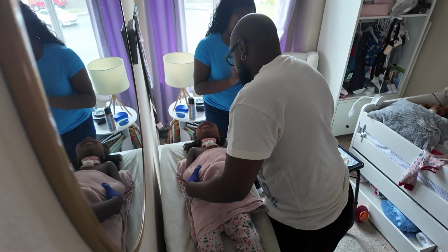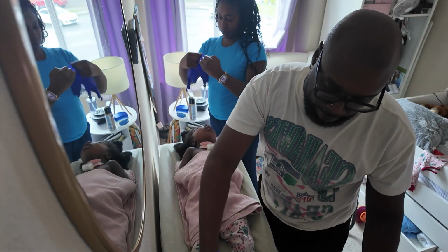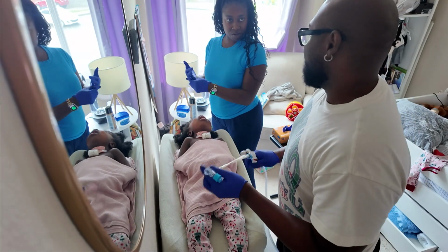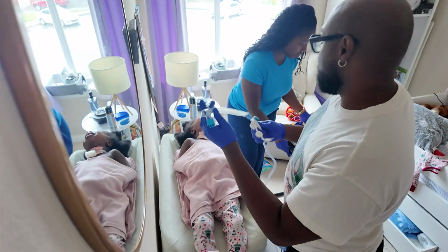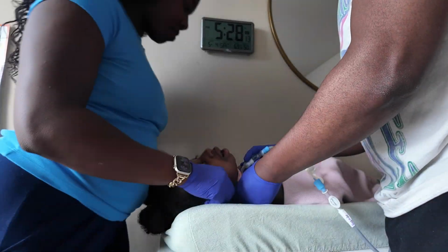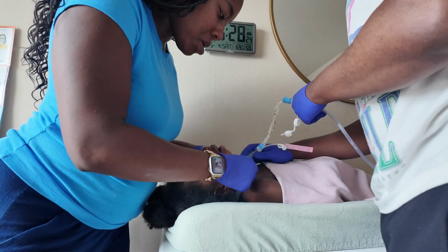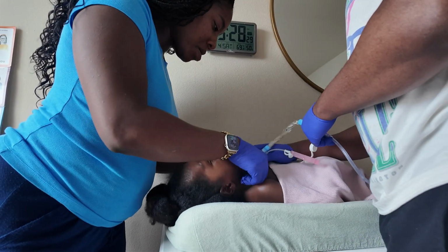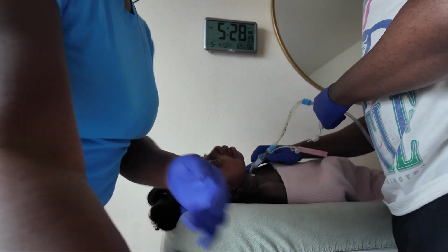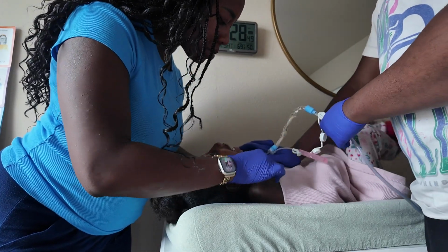As you see, she's already kind of moving. One of Rome or myself will do this with a nurse. And so today it's me and my husband doing it together. We are gloving up. We have the trach right there. We're going to attach her suction catheter and it's going to stay attached the whole time. So Rome's job is to hold. He is going to hold and he is going to turn the suction machine on. We are talking throughout this whole process. And we have found a great way for where his hands should be so I can move around. As you see, her legs are already moving.